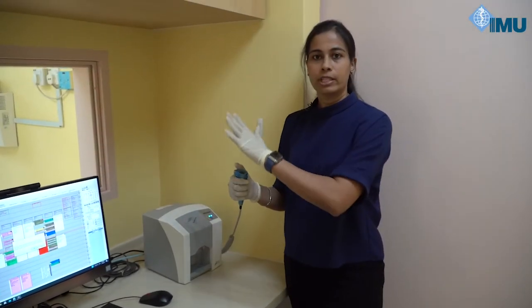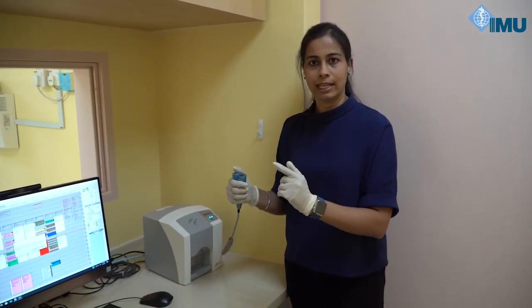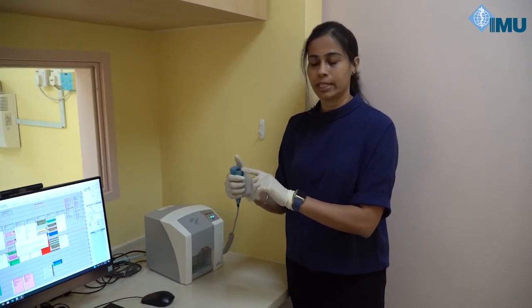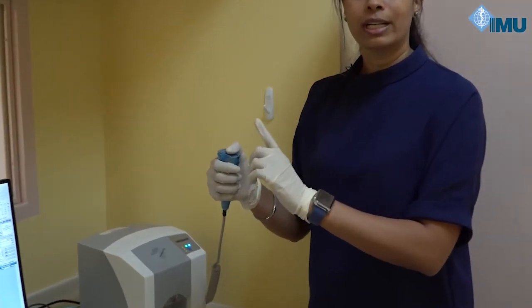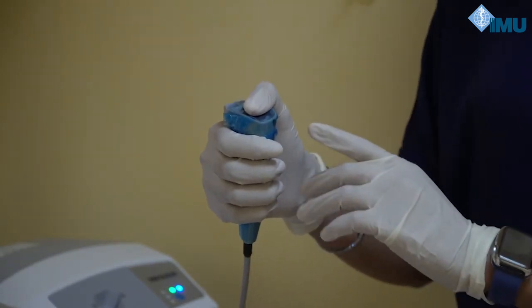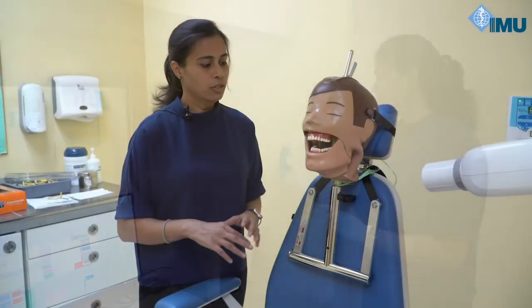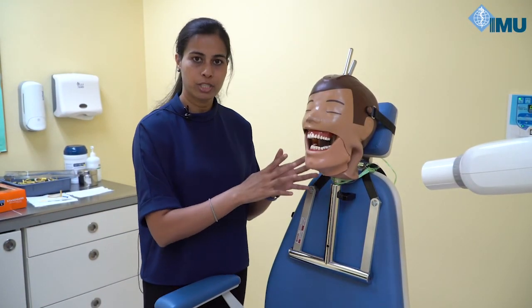After positioning everything, inform the patient not to move the film with their tongue. Then promptly come and expose the imaging plate. Press the exposure button and do not release it until you hear the beep. After the beep stops, release the button — that is when exposure is completed. This completes the bisecting angle technique for mandibular and maxillary posterior teeth projection.